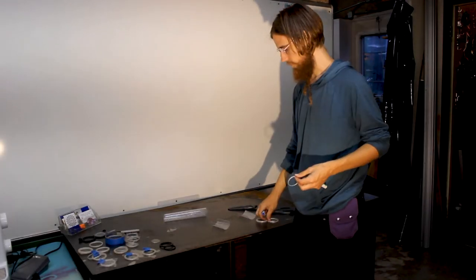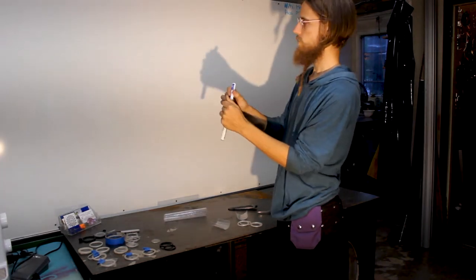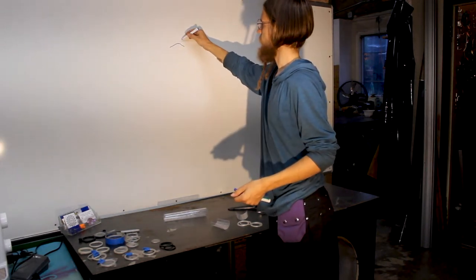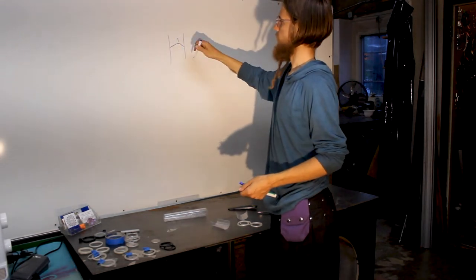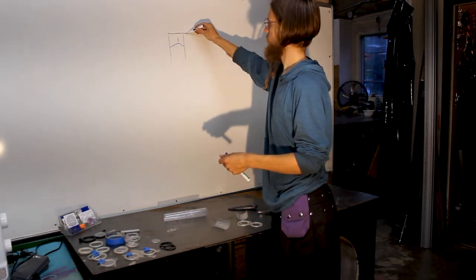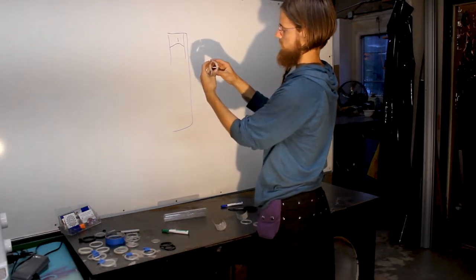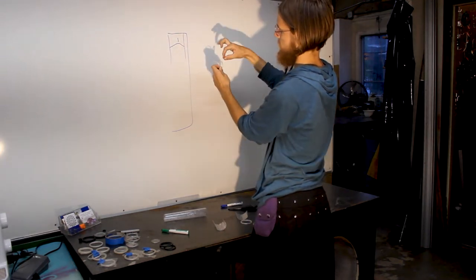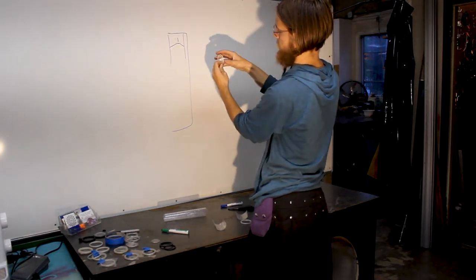All right, so you have to find the ring that is the inner ring, and it has a shape to it that looks kind of like this, where one of the humps is closer to one side, and that's the side that's gonna be on the inside of your lens. So as you're pressing down in, the side with the hump, the hump will be closer to the inside edge. So this hump will be on the right of this as it goes in.